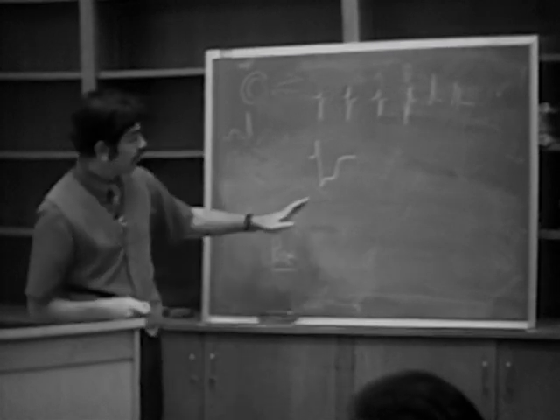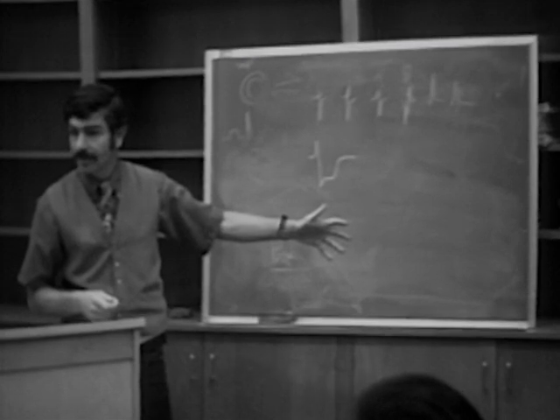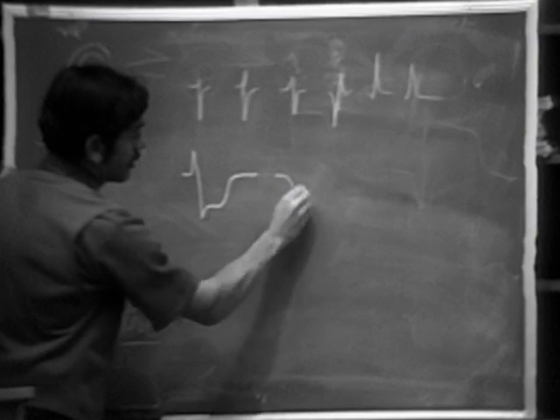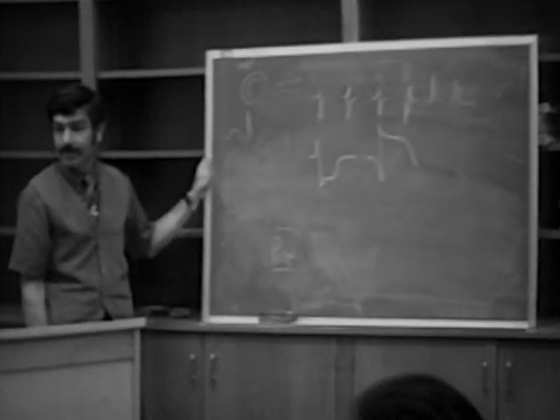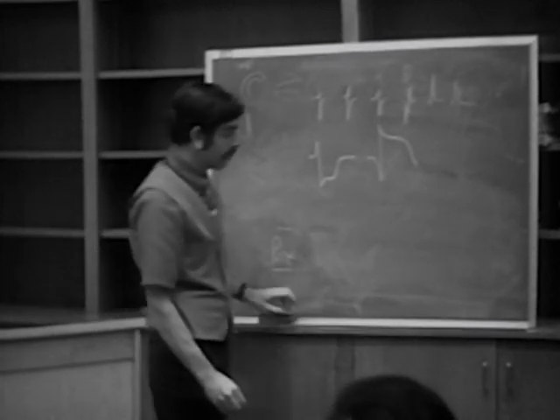Now, but if you were to turn this upside down in your mind, you'd recognize it for what it was, really, right? And think of it as a reciprocal change. So we'll do that. We'll just turn that upside down, and everybody recognizes that old friend, right? That's infarct, right? So what we're doing is looking at mirror image changes.